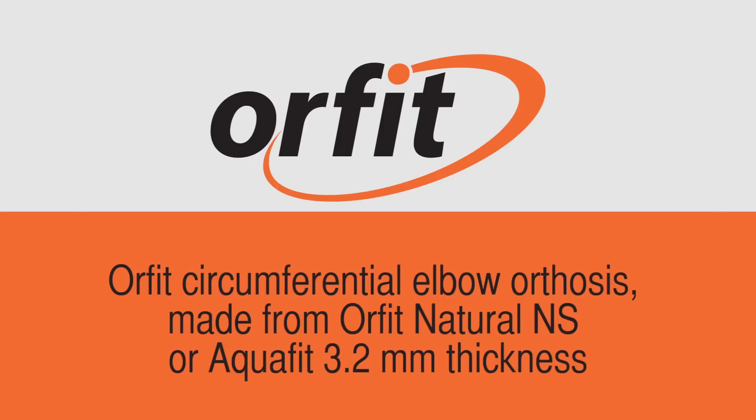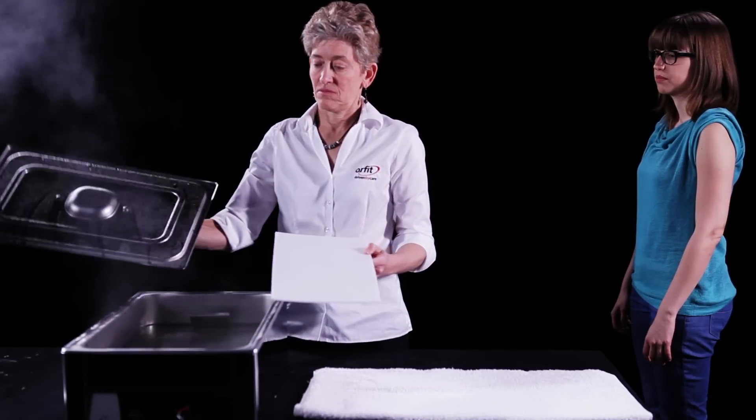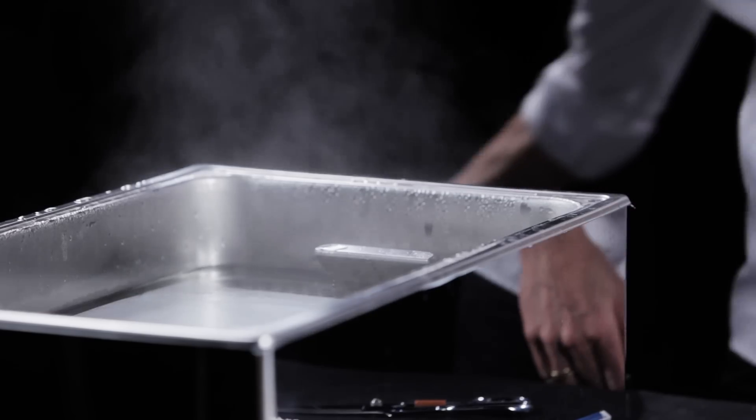This is a demonstration of a circumferential elbow orthosis made from Orfit Natural NS or Aquafit in 3.2 mm thickness. No pattern is needed. Use one quarter of a sheet of thermoplastic material, 9 by 12 inches or 22 by 30 cm.